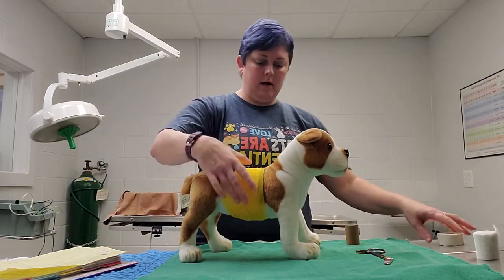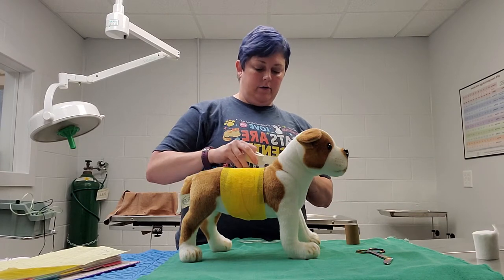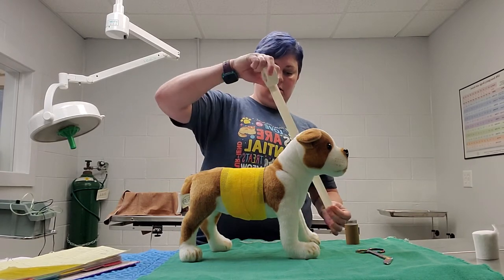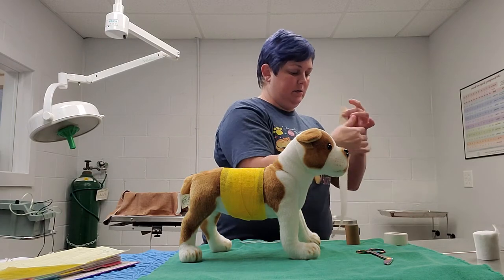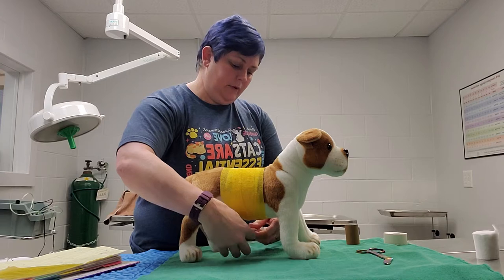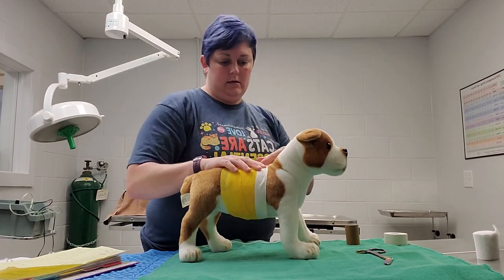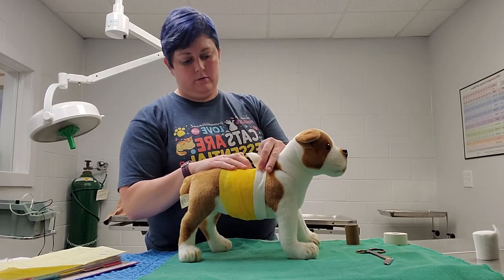After the vet wrap, we're going to take some tape and go around the front of the dressing and the back just to kind of hold it in place. We're going to go half on the skin and half on the vet wrap.